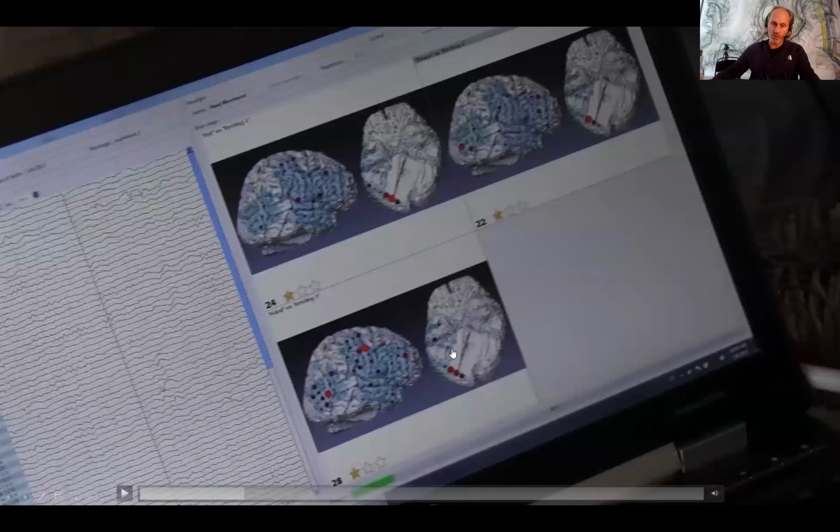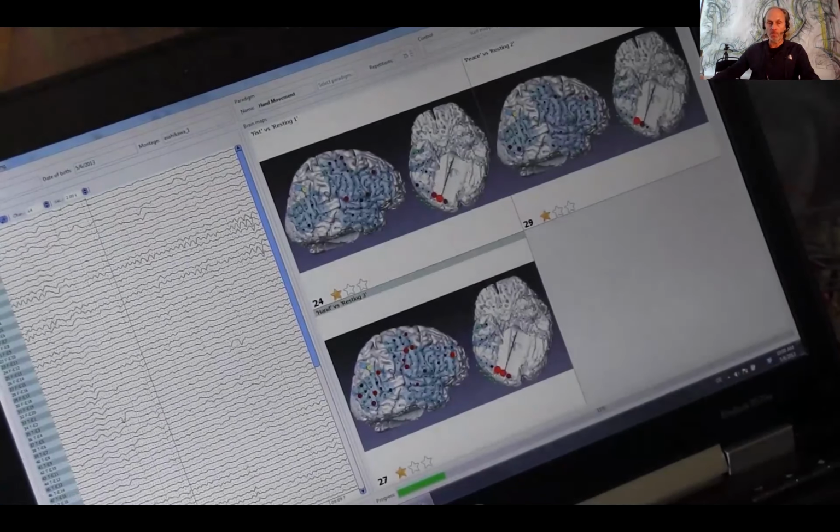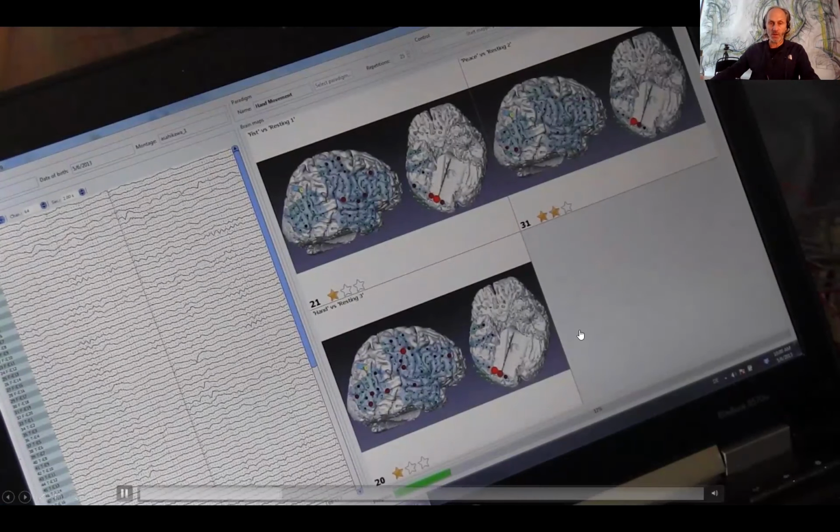So the face region, for example, is located approximately here. And neurosurgeons just removed tumors or sources of epilepsy if they were located here. And this had the consequence that people didn't recognize, for example, family members anymore. So nowadays with the cortiQ mapping, we can pinpoint these locations and we don't remove them anymore. Not me personally, our research partners like Dr. Kamada.